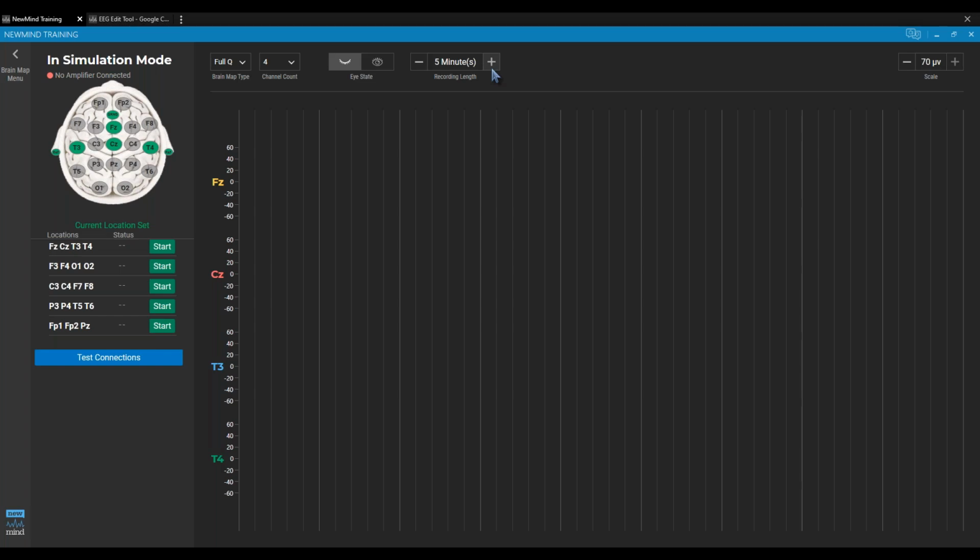Maybe do an SMR with a high beta down, which we know will definitely help with sleep. We'll give the brain some stability. The high beta down should help relax them a little bit, and then maybe come back 10 or 15 sessions of SMR later and try to acquire the map again, and just do the best you can.